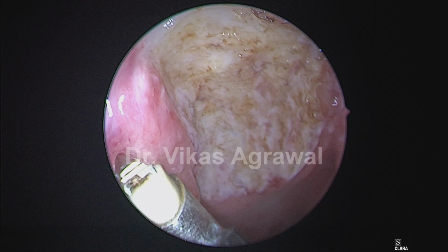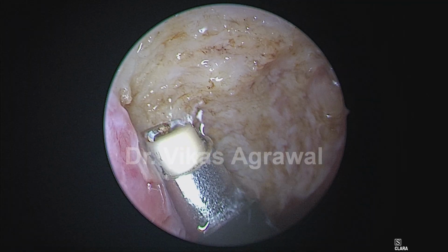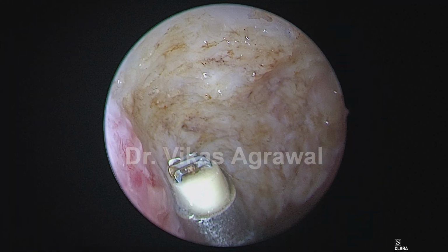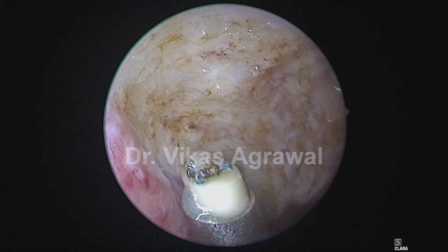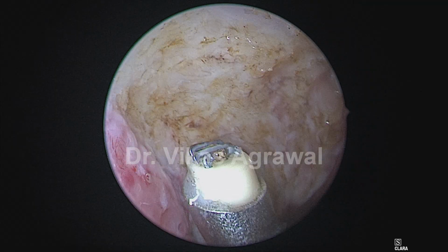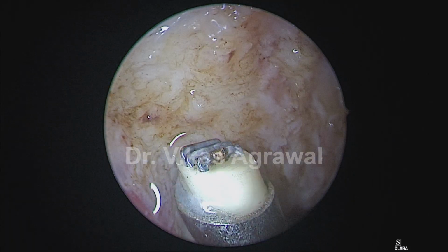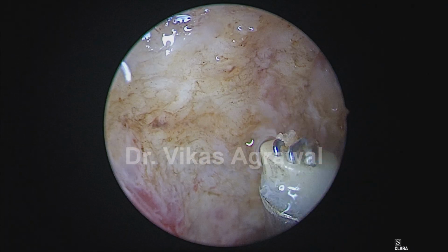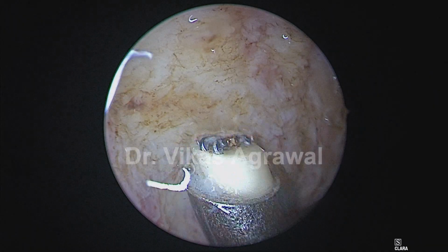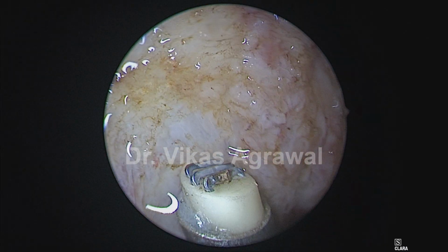So this is the torus tuberous, that's the eustachian tube. If I follow this superior boundary posteriorly, I'll get into the posterior boundary, which will be the buccopharyngeal fascia. So now that this is the superior boundary completely cleared, you can see the buccopharyngeal fascia already partly here. I'll show it to you completely. We are not supposed to open up the fascia. We're only supposed to define the fascia. So that is the fascia.